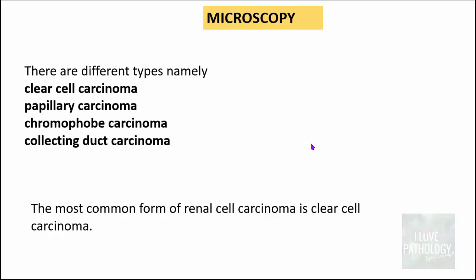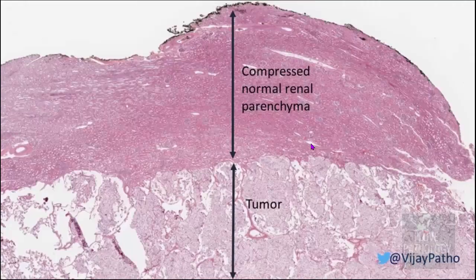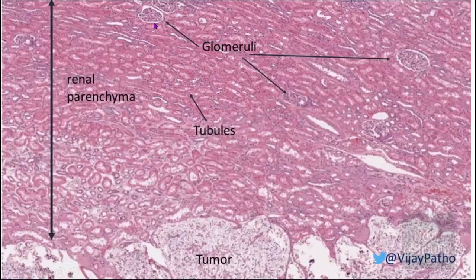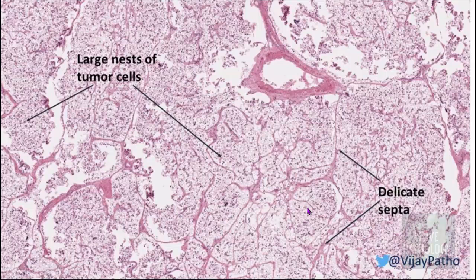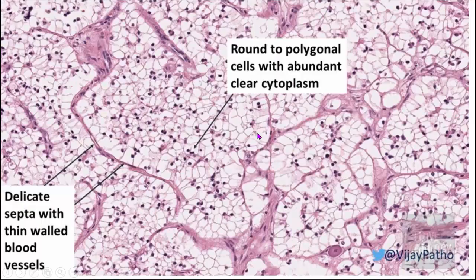At scanner magnification, you can see the compressed renal parenchyma adjacent to the tumor, which appears paler than normal. At higher magnification, you can identify the normal kidney by its glomeruli and tubules. The tumor consists of large nests of tumor cells separated by a delicate fibrovascular septa.